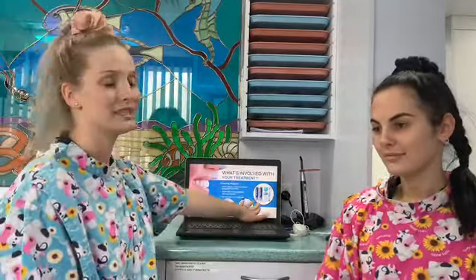So cleaning our aligners is also really important. Our mouth is full of bacteria, so we want to make sure that we're cleaning our aligners every morning and every night. So we can clean our aligners with our toothbrush and toothpaste. Otherwise, we also sell this cleaning kit out the front. It has 60 tablets, a container and a brush, and all you need to do is soak your aligners in it for 20 minutes a day to keep them nice and clean.